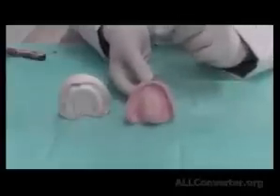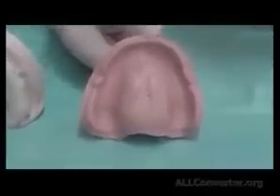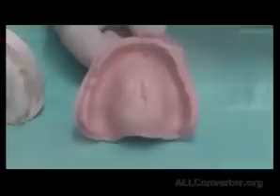So we make sure that our impression is perfect, and this is ready to be disinfected and sent to the lab. Zinc oxide eugenol is a material that is stable. It could withstand the soaking in disinfectant materials, and we disinfect it in a medium strength disinfectant, and we could soak it there.